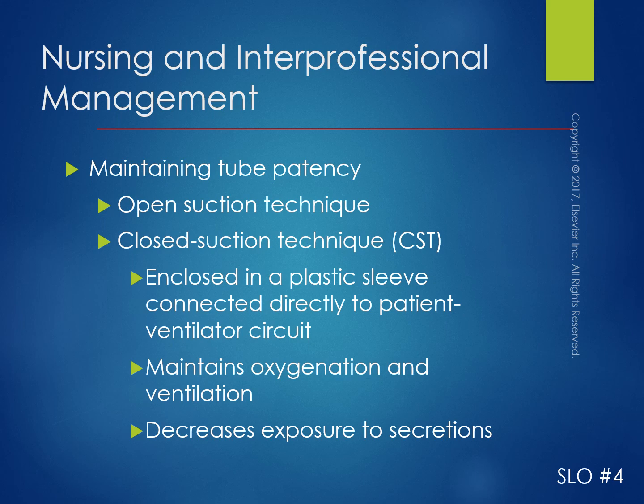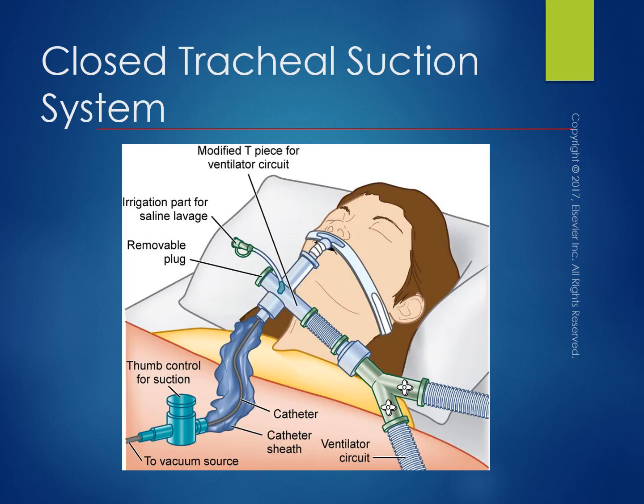You'll see it in the video, but this way the suction stays on at all times, and it's hooked up to this, which is off until you turn it on to use it. And then it prevents any foreign bacteria or objects from getting into the suction catheter during suctioning. It also decreases exposure to you as the nurse when suctioning this patient.